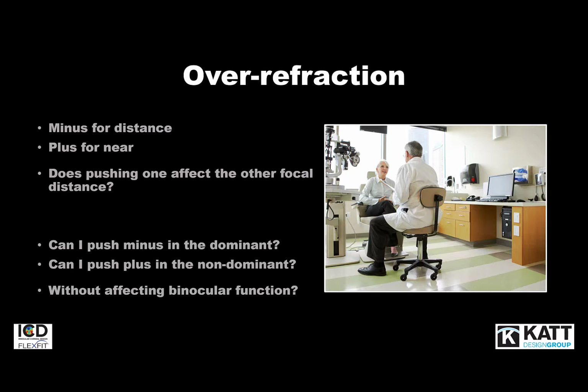We also might explore, can we push more minus in the dominant eye, maybe more plus in the non-dominant eye? Does that affect the binocular function? Again, the usual multifocal rules apply. And let's see, with a simple power adjustment, if that provides all the focal distances the patient requires to achieve a successful outcome.